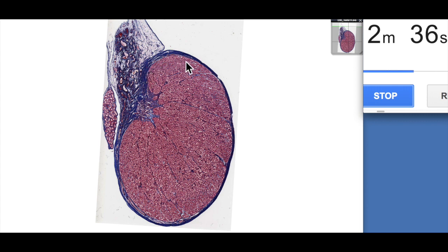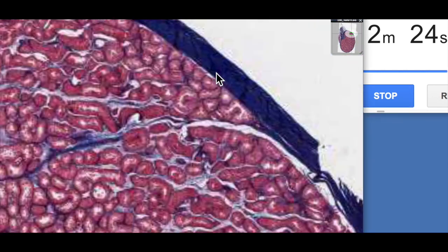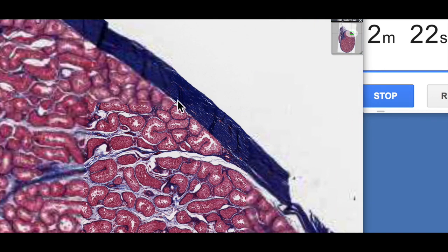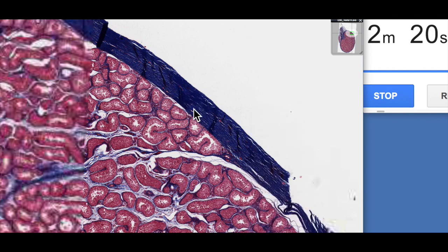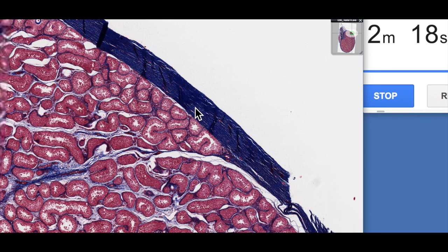You can see this is a trichrome stained section. Blue is collagen and you can see this very thick dense blue layer around the outside of the testis. This is known as the tunica albuginea, or the white layer. If we have a look at a little bit higher magnification here you can see it's a very thick dense connective tissue layer.